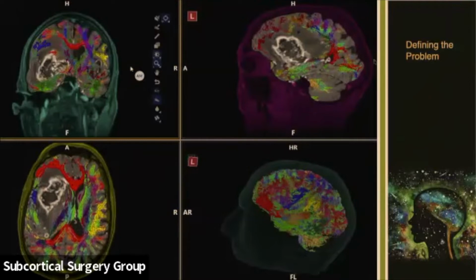And for a microsurgeon, the brain-tumor interface is really the key to the resection of gliomas. In certain metastases or primary tumors, you can rely on capsular or extracapsular dissections. In glioma, you cannot. So much of the voodoo in medicine, some of the dogma, some of the things which perhaps are panned out by science to not be true, have to do with where to stop the resection. And I'm a firm believer in the awake craniotomy methods described by so many people and by the deep white matter stimulation methods. But if we can have an imaging modality to define those borders, I think that would be superior.